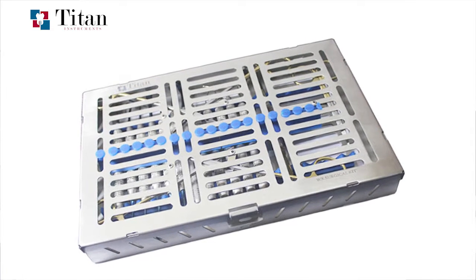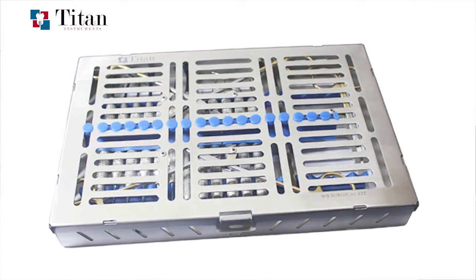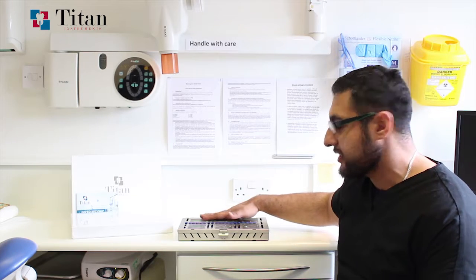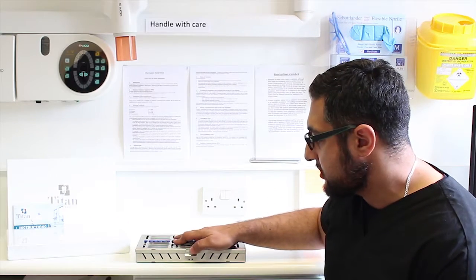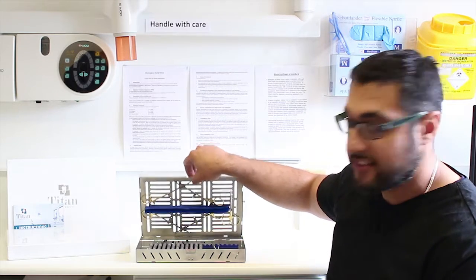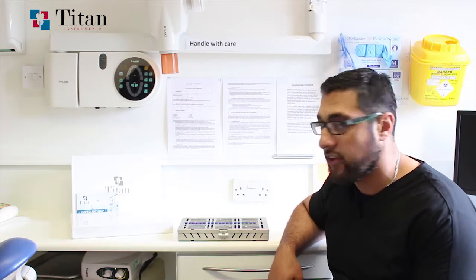We've been developing this for quite a long time and tried to develop it from the outside in, making sure that everything is as easy to use for the dentists and their nursing staff as possible. Looking at the outside cassette, many cassette designs fail on the catch at the front. We designed it so that it was a simple push action which spring-opens the cassette and a simple close to make sure everything is sealed off nicely.